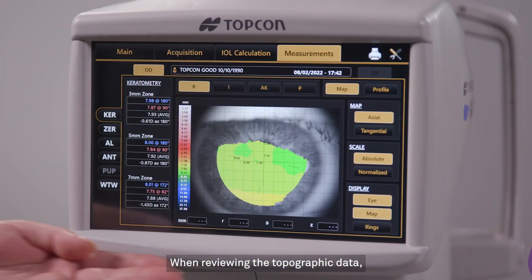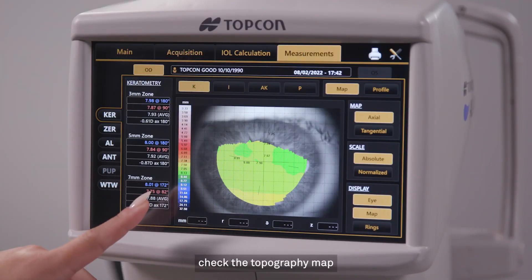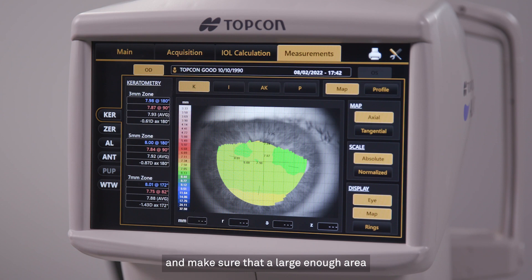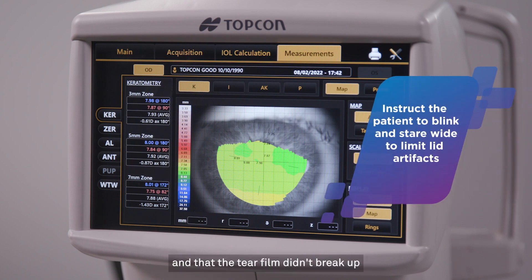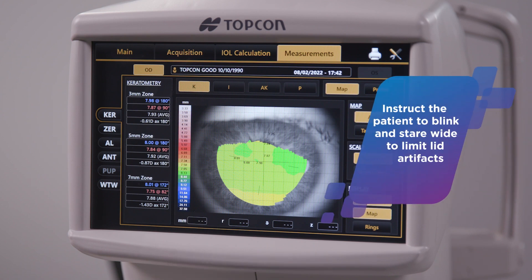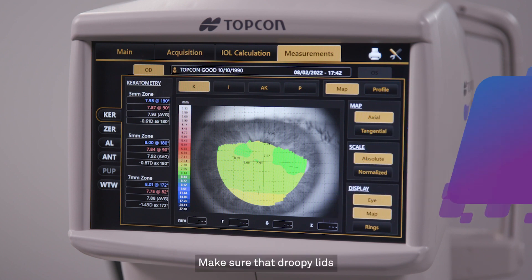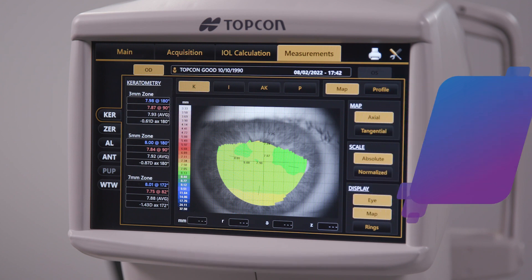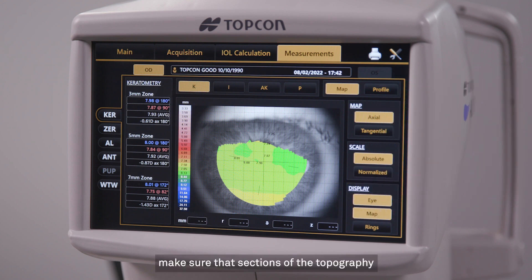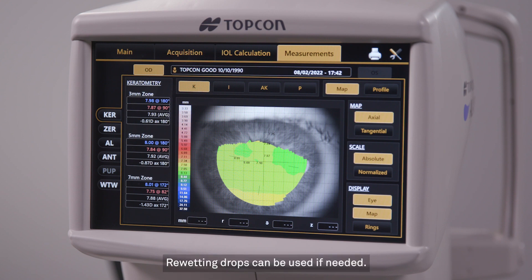When reviewing the topographic data, check the topography map and make sure that a large enough area was captured and that the tear film didn't break up and cause loss of data. Make sure that droopy lids or the side of the patient's nose didn't interfere with the acquisition. Also make sure that sections of the topography are not missing due to tear film breakup. Re-wetting drops can be used if needed.